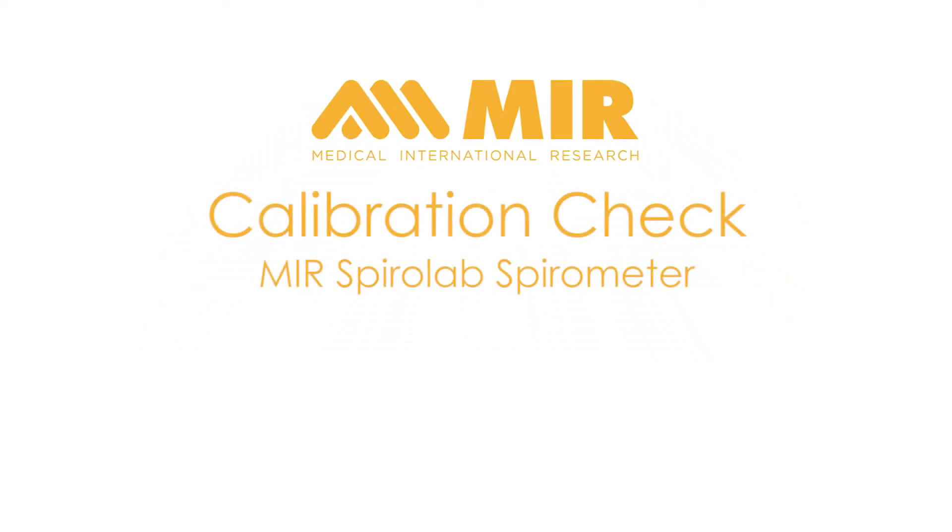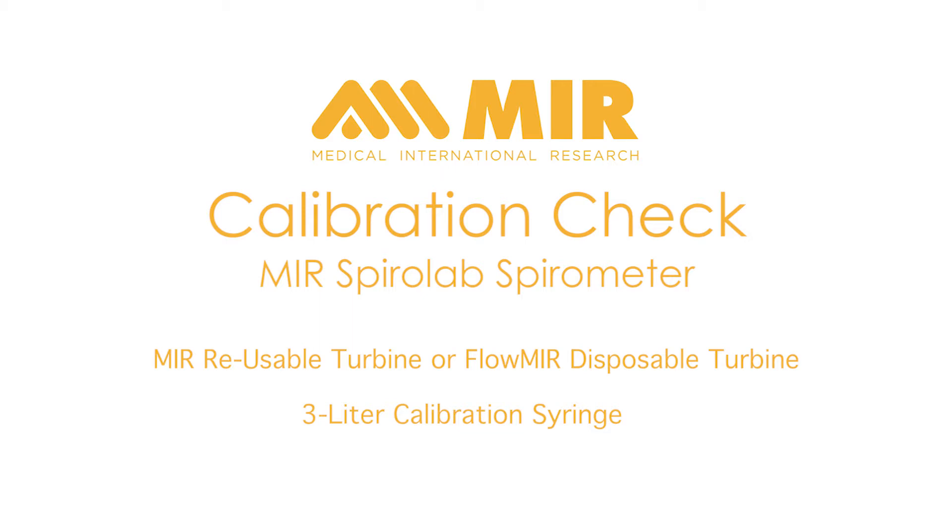This video is designed to show you how to do a calibration check with an MIR SpiroLab spirometer and either the MIR reusable turbine or the Flomir disposable turbine and a 3-liter syringe. For this video, we will be showing the MIR reusable turbine. Because the Flomir disposable turbine is pre-calibrated when it is manufactured, it may not be necessary to do a calibration check unless it is required by your facility or organization. The calibration check procedure is exactly the same if you are using the Flomir disposable turbine.